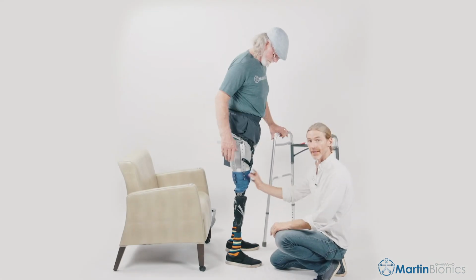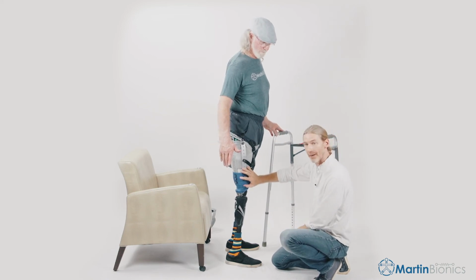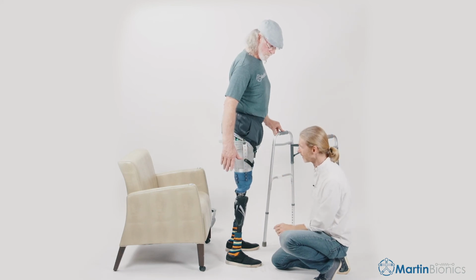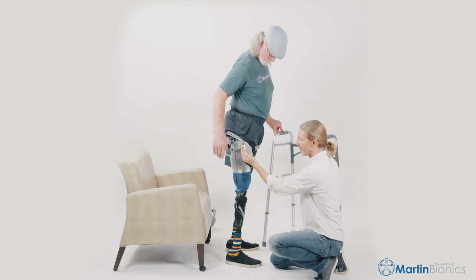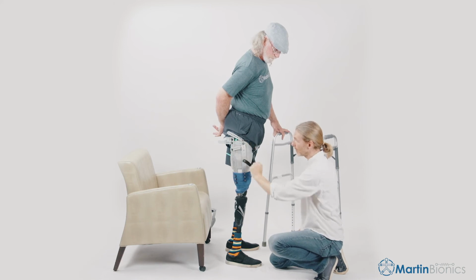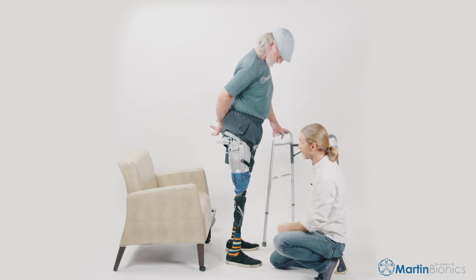So we've got the CX hybrid fit. Now, Tom's wearing his original CX socket on the left side, the new CX hybrid we just made on his right side. Now, the three things I'm looking for is really just the position of the two lateral struts. The anterior lateral strut should sit kind of about where the front edge of the lateral wall trim line would round out to. The posterior lateral strut sits just posterior to the trochanter, proximal an inch, and then running straight down the limb. That looks good.